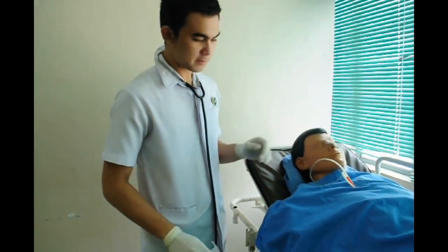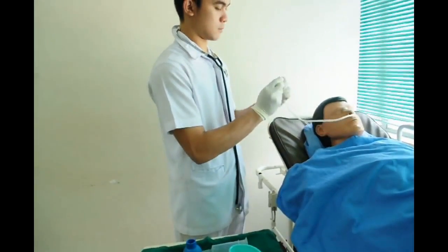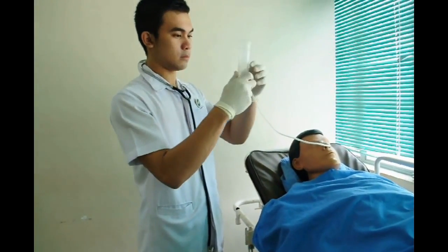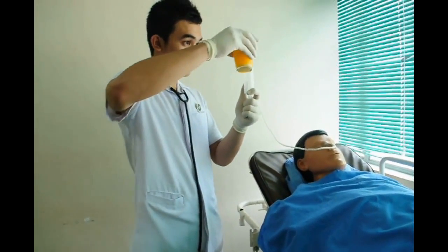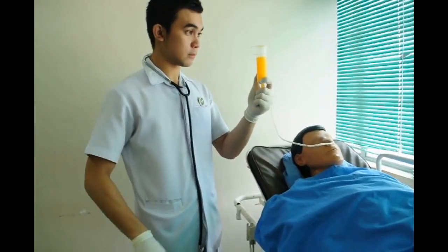Okay, I'm done preparing. Administer feeding. This is to let the blenderized feeding flow by gravity. Raise the syringe as high as possible.